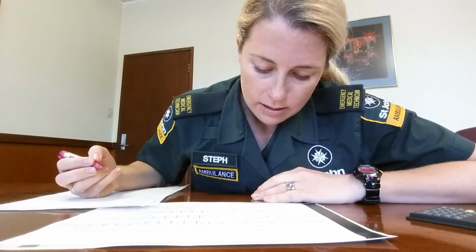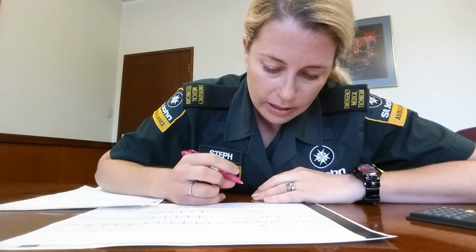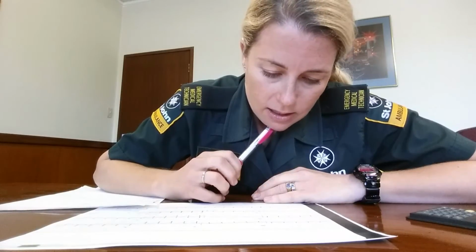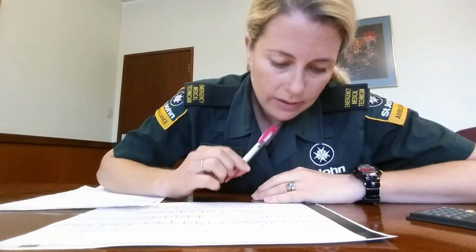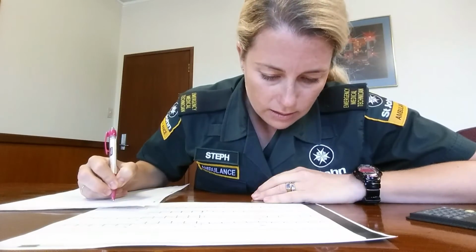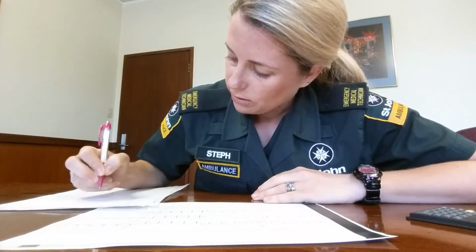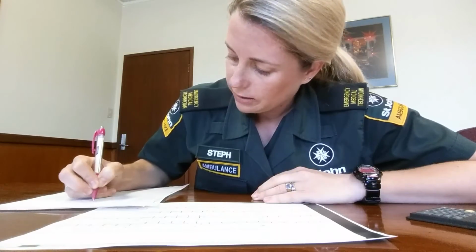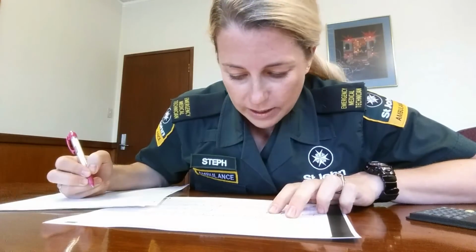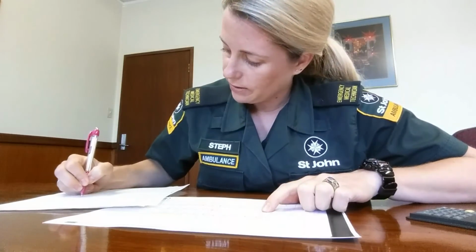My ST segments, I'm looking for elevation or depression greater than 1 mil in contiguous leads in the limb leads, which I do have elevation in 2, 3, and AVF. So I'd want a V4R to look at reciprocal changes. Yes, I would want that, but I'm looking for reciprocal changes in 1 and AVL, which there is some in AVL, so I'm quite certain that we have inferior.